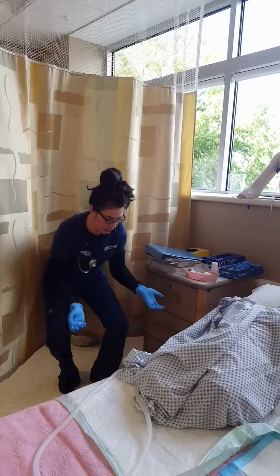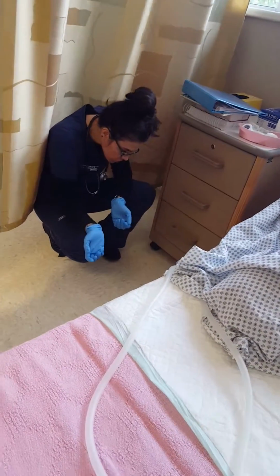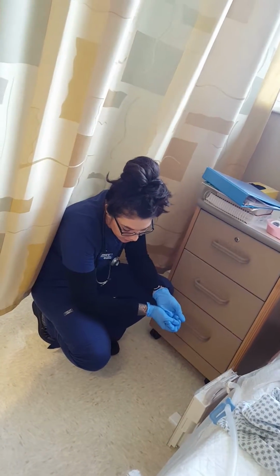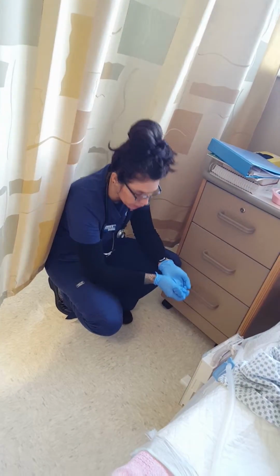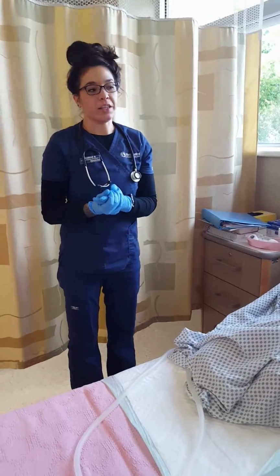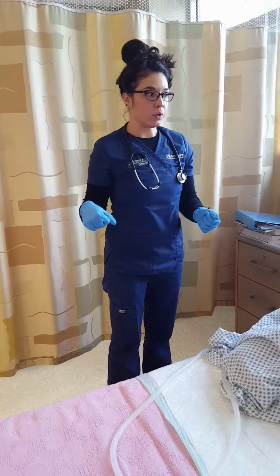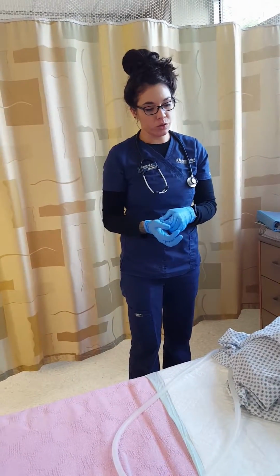And then I will get down and check my levels. And I want to put a mark of where it's at with my initials and the date and time so that we can track the accumulation. For lifespan considerations, if this was an elderly that had dementia or was confused, you would want to check on them more frequently to make sure that they did not dislodge the tube.